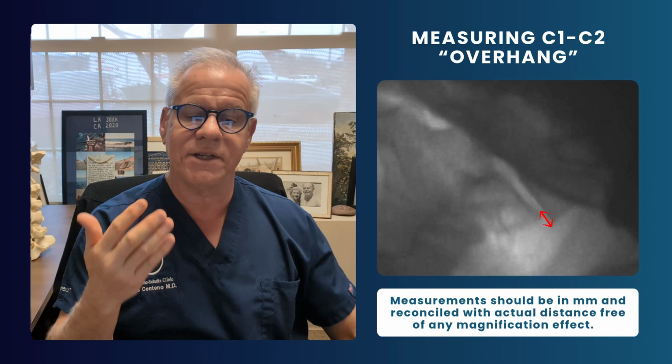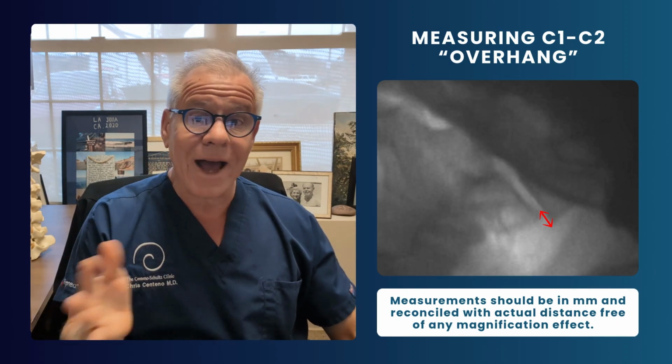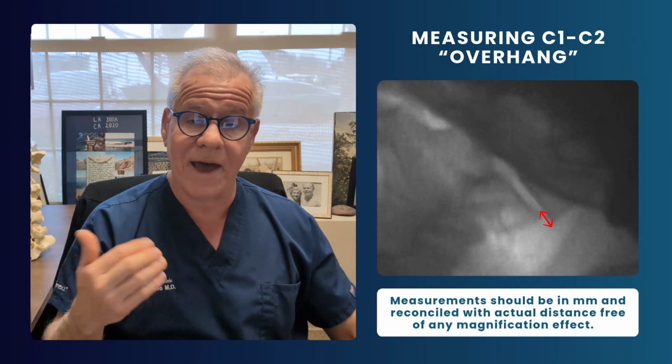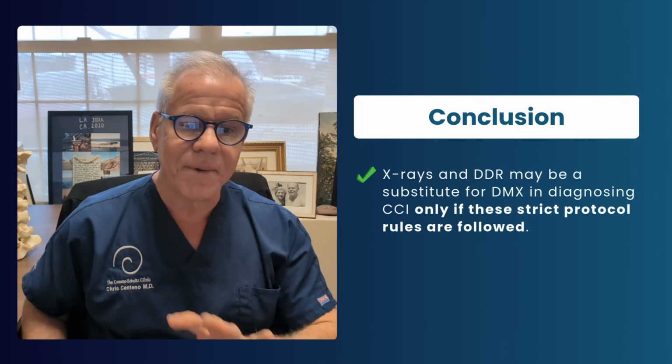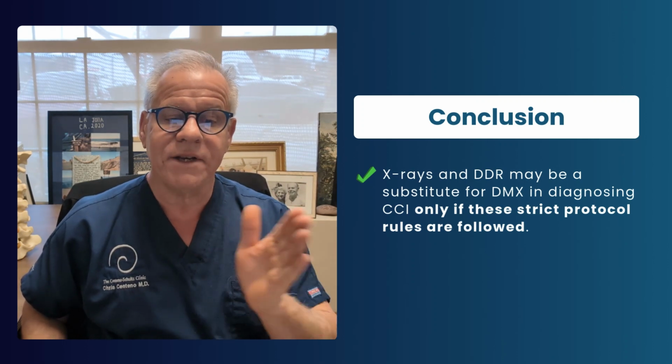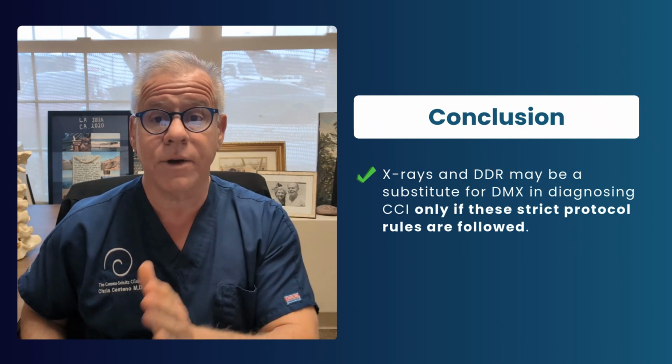We're looking for measurements in millimeters reconciled with actual distance to make sure we're free of any magnification effect of measuring on the film. In conclusion, X-rays and DDR may be a substitute for DMX in diagnosing CCI, but only if these strict protocol rules are followed. I'm happy to look at these images and to provide any additional information to the imaging center, but we can do this if we can get films just like this.